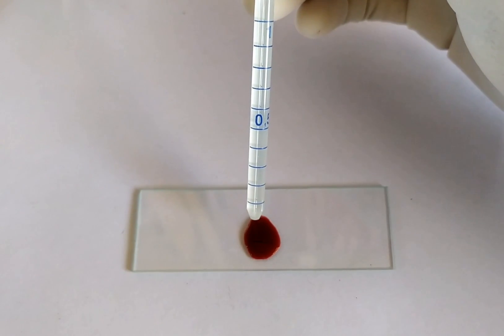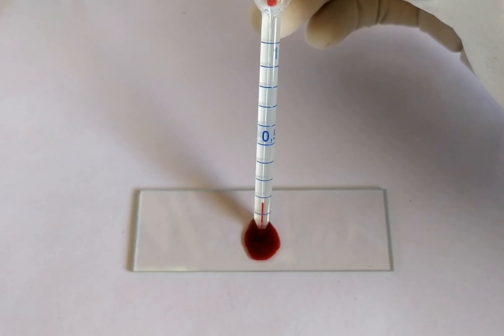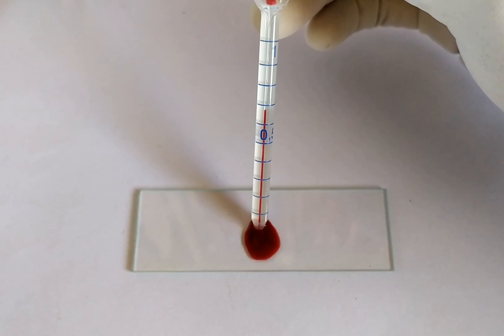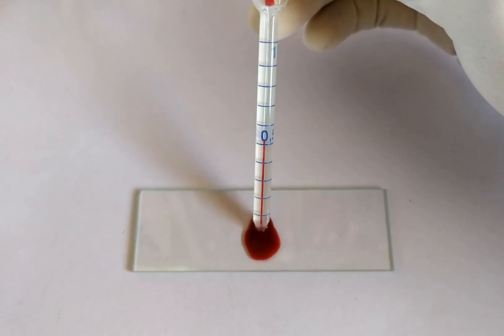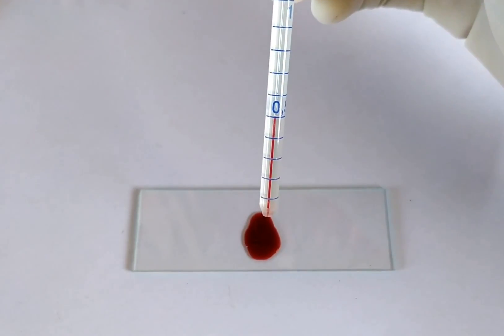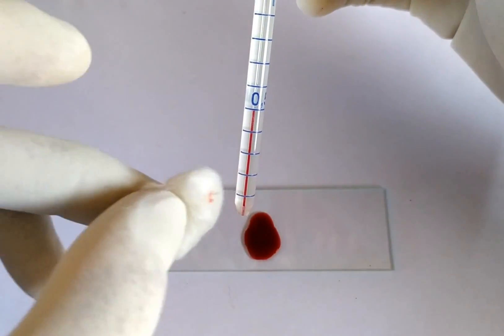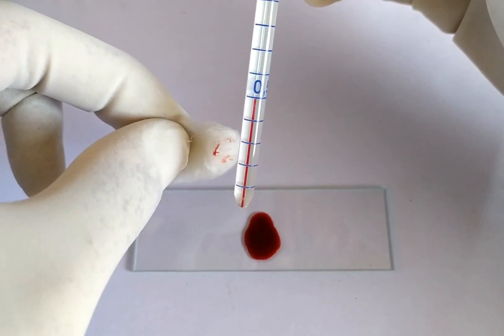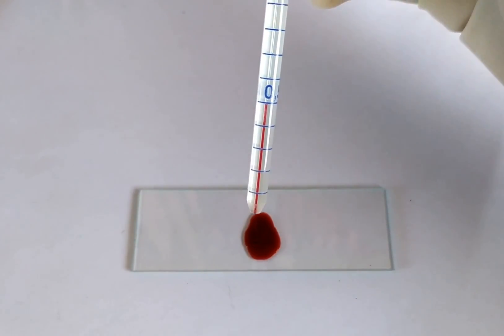Take the RBC pipette pre-cleaned with alcohol. Draw the blood sample till the 0.5 mark using your mouth or a syringe, taking care to avoid any air bubbles from entering the pipette. This step requires a bit of patience and practice. If you happen to suck the blood beyond the 0.5 mark, you can either use a clean filter paper to carefully blot out excess blood from the pipette tip, or carefully blow out excess blood using a syringe until it reaches the 0.5 mark. Once done, carefully clean the excess blood sticking to the outer sides of the tip of the pipette using cotton soaked in alcohol.